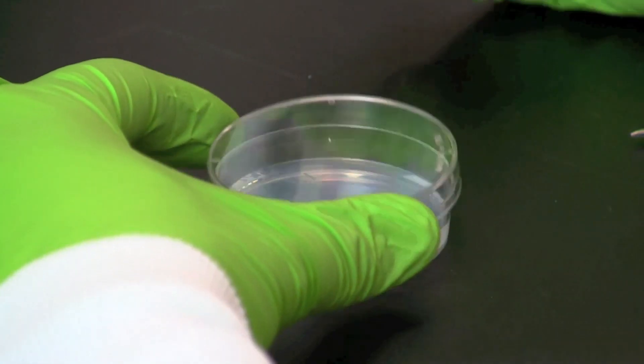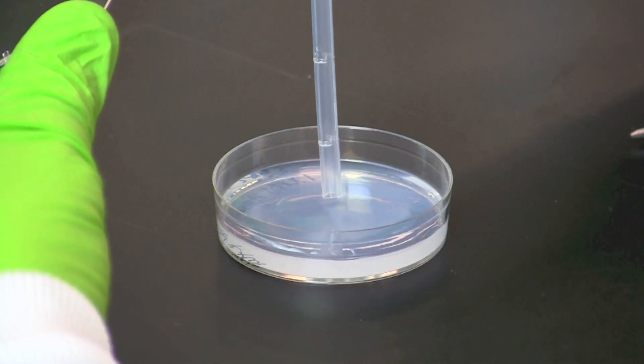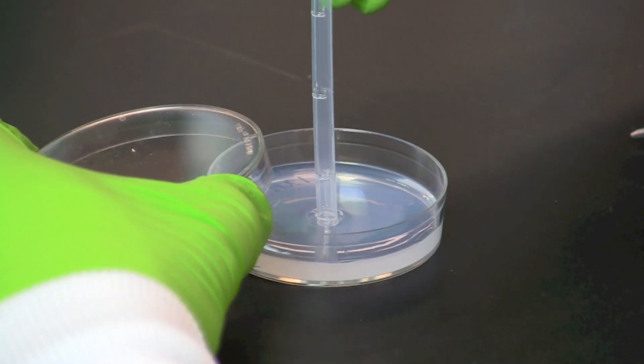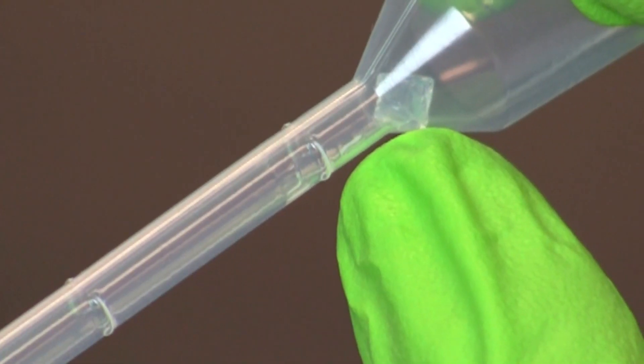Start by punching a hole in the center of the assay plate. Squeeze the bulb of the transfer pipette and press the tip of the pipette into the agarose. Release the bulb to suck out the small plug of agarose. You should be able to see a small plug of agarose in the bulb of the pipette.